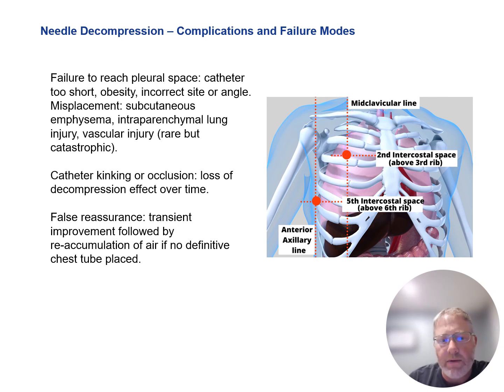If you have any misplacement into the lung parenchyma or a vessel, that's rare but serious. And yeah, always be meticulous. Pay very careful attention to the landmarks for insertion, which greatly minimizes these risks.